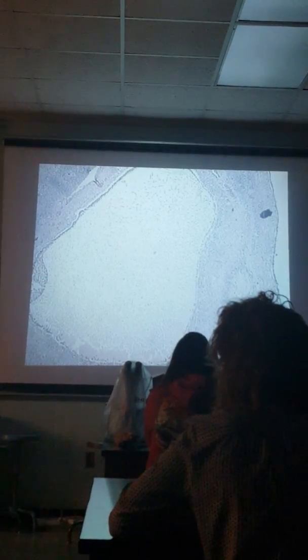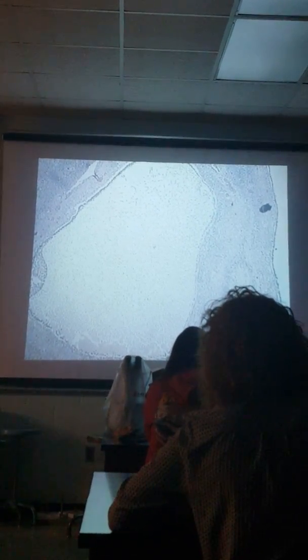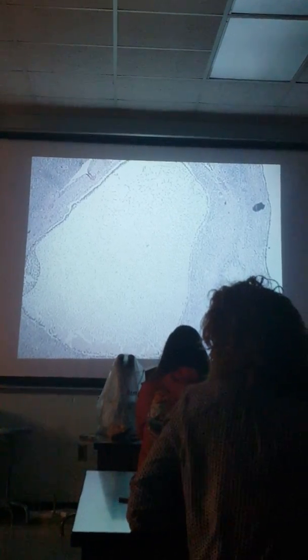Like a cat or a dog or something, you know, has multiple births, they're going to ovulate multiple eggs. Humans, which generally just have one child, only one egg ovulates. But animals that have litters need to ovulate multiple eggs. That's why they use rat and cat and stuff like that, because they have litters, and so you can see a lot of stages in one ovary.